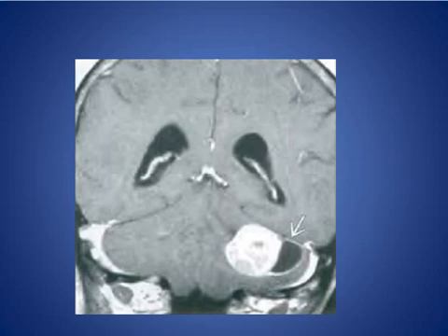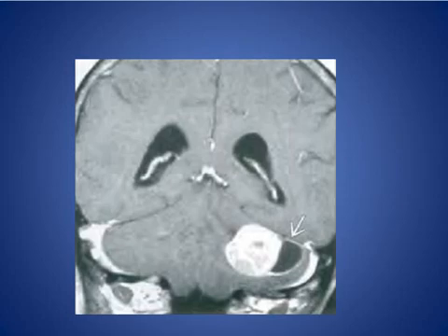Here, coronal MRI T1-weighted images show a cystic mass with an enhancing mural nodule in the left cerebellum. It looks like a hemangioblastoma, but in hemangioblastoma the wall is not enhancing. This is actually metastasis.